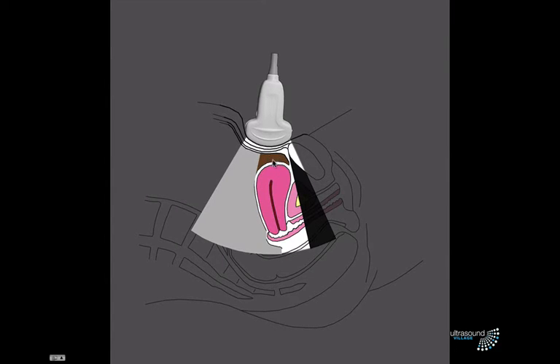You might get a little bit of fecal material with little air in it, but this is what you'd see. Yes, you'll see bowel gas here, and you won't get a great picture here, but you should see the anteverted uterus, the endometrium, a bit of vaginal stripe, and a bit of bladder.